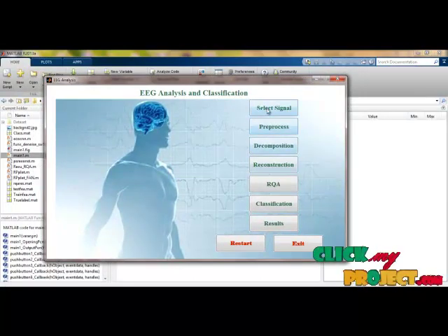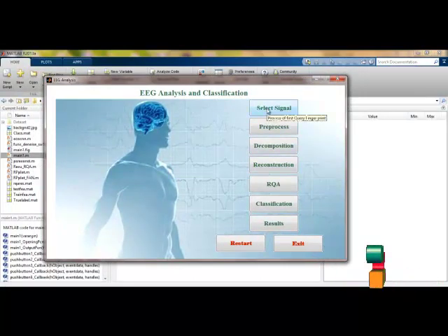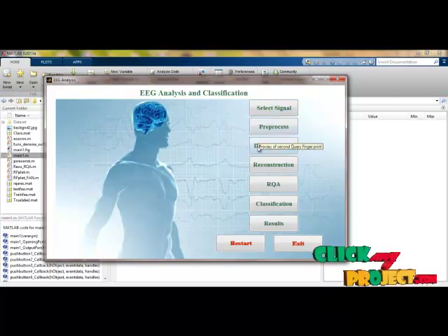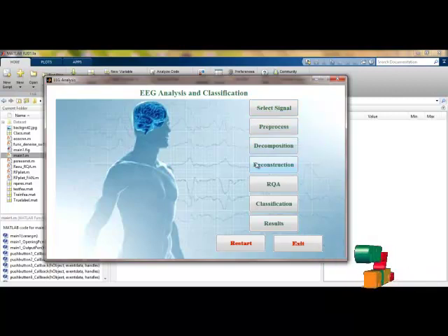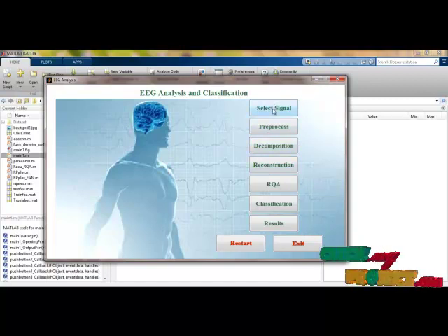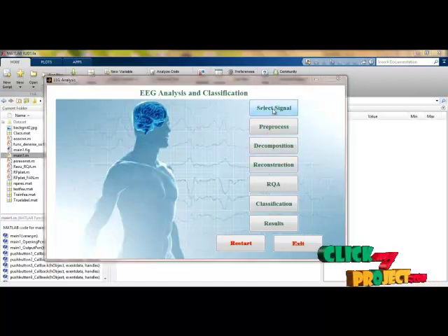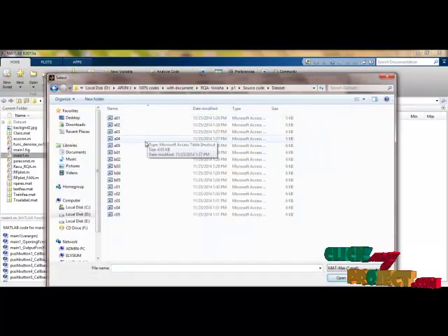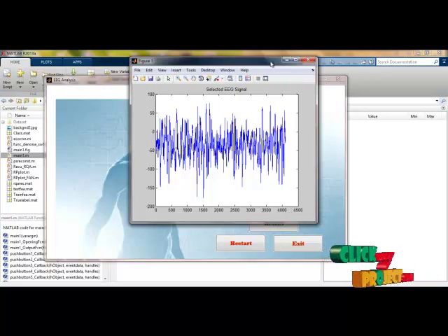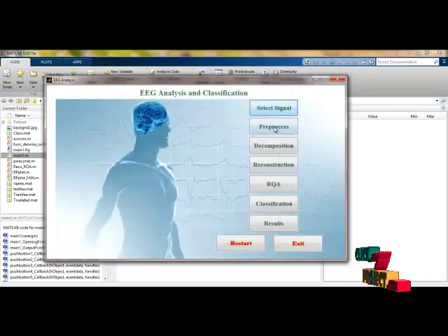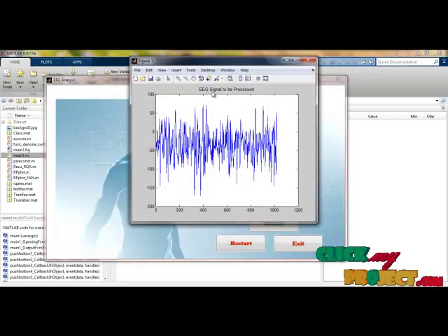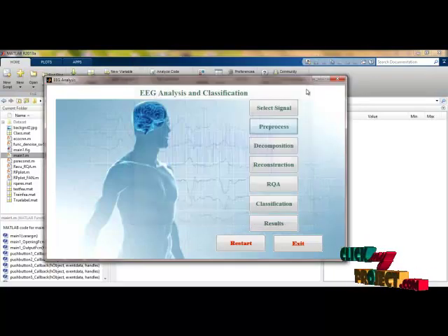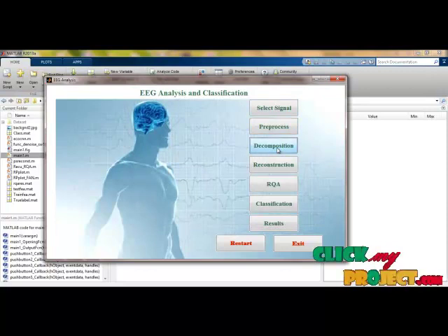Initially we have to select the EEG signal as input. A tooltip is shown for every push button when you hover near it, which tells what process that push button performs. Let us select the input signal — it navigates to the input dataset and we select a case. This is the selected EEG signal. Then preprocessing is performed: the signal is normalized and ready for processing.